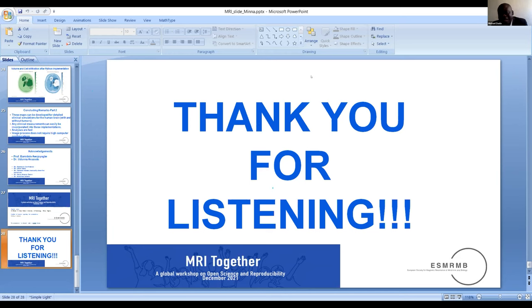From my experience, I feel that we should focus more on the T1 and T2 relaxation rates, that's the MR fingerprinting data. You notice that this data could be very close to each other. Sometimes you could have a T2 value of 0.4, and then the next one is 0.42. They're very close to each other, but for the little difference between them, that's 0.02, we can use computational models to expand the small influence there in order to have a better classification model.